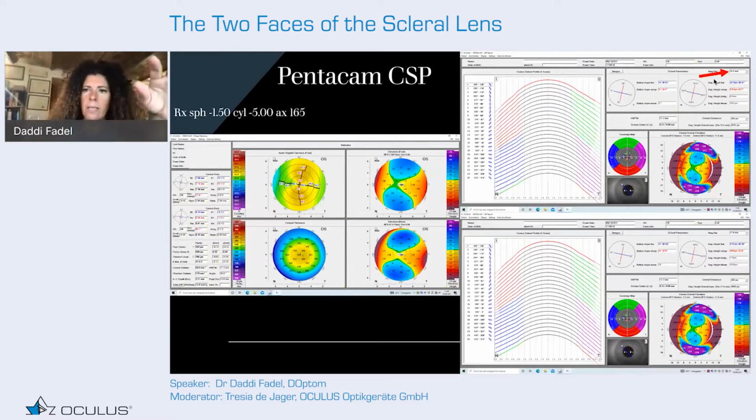Here in this area, you have to choose the chord of the eye for which you need the information, and the software gives you all the information at that chord for the scleral lens selection. You can choose the initial central clearance desired, and the software calculates the lens sagittal height that you need to apply on the eye.